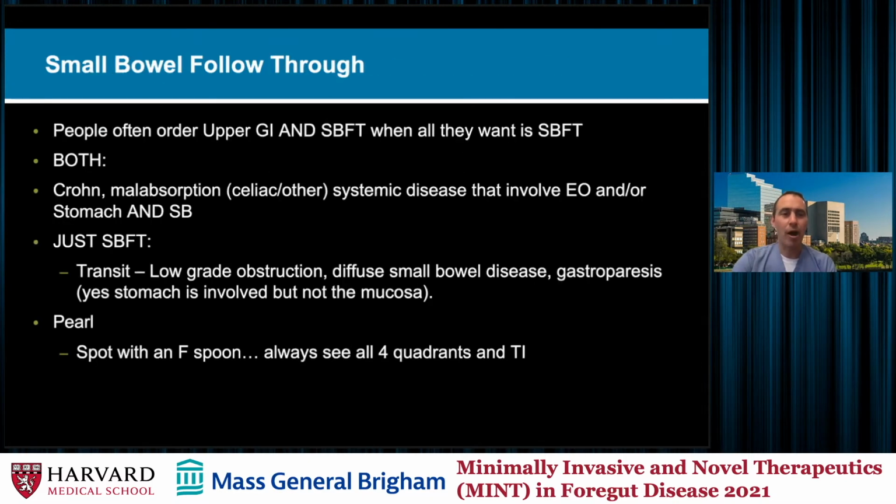Hooray, patient safety. All right, so small bowel follow-through. A lot of people order upper GI and small bowel follow-through when all they want is a small bowel follow-through. All right, attention to everybody.